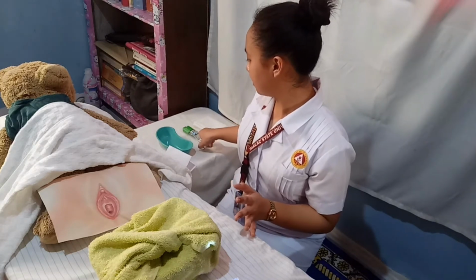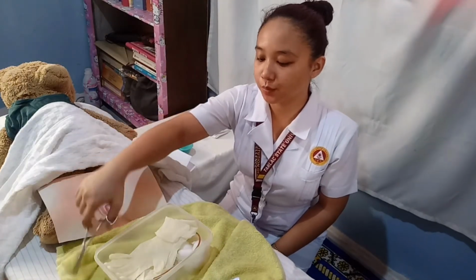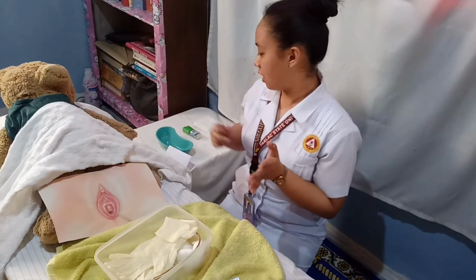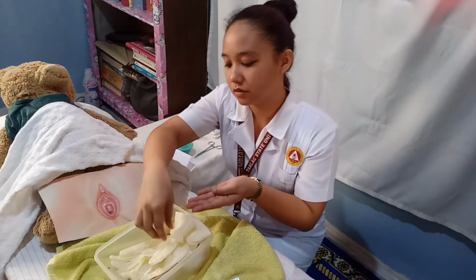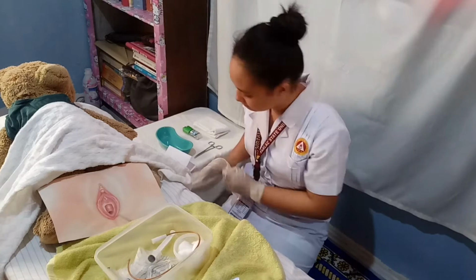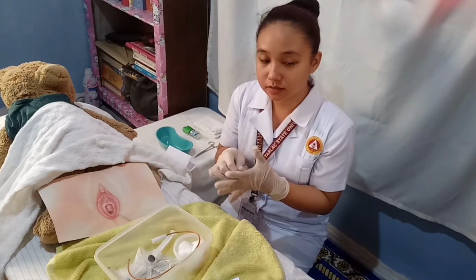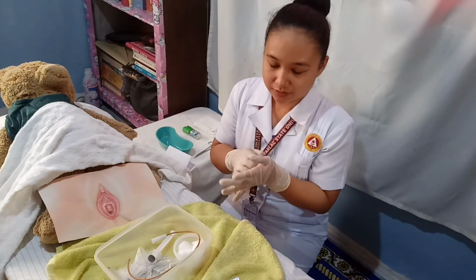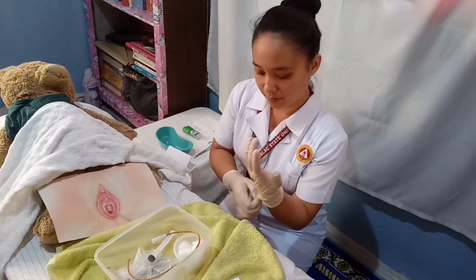Now we need to open the sterile catheterization kit with a sterile technique. Now we need to put on our sterile gloves. So let's say, for instance, this is a pair of sterile gloves. Now we need to place the fenestrated sterile drape on the perineal area.